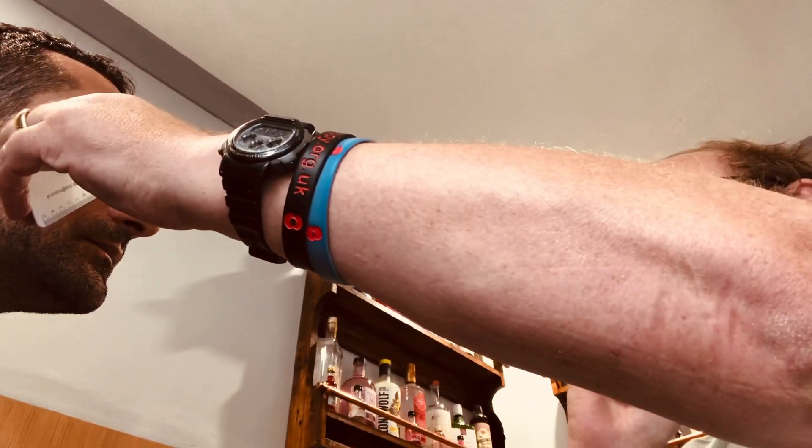I'm going to take some measurements as if I'm going to fit you with a pair of spectacles. One of the first measurements is to see what distance your pupils are. Before I do that, I'll do a cover test. I want you to look at my left eye — there's no movement there. Now look at my right eye — again, no movement. Perfect, so there's no esophoria there.